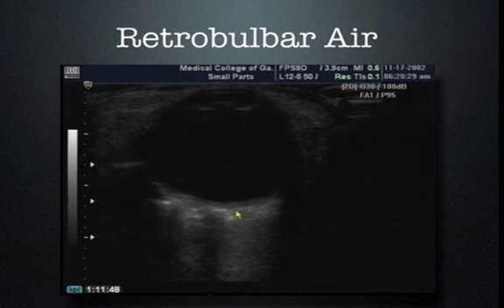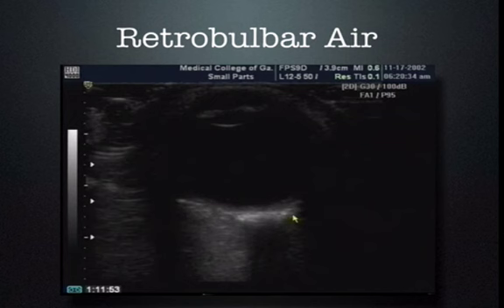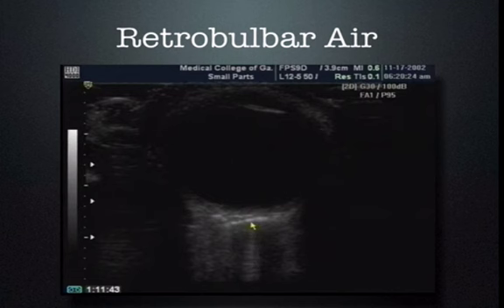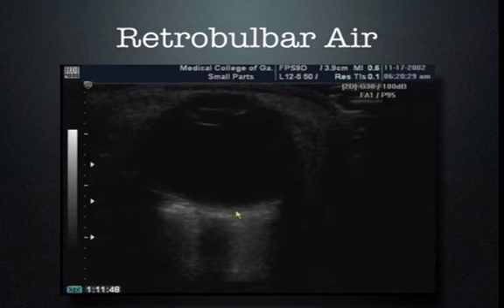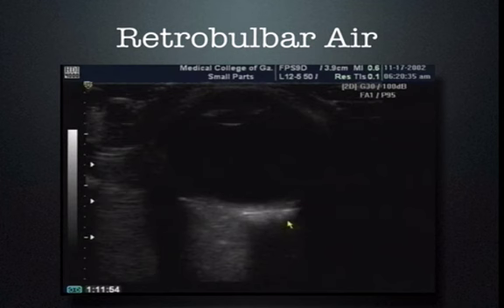Retrobulbar air will be found in some cases. The air appears as a bright echogenic line causing a dirty shadow, and it moves with patient positioning or head and eye positioning. This could indicate a sinus fracture or something else. It's easily seen because air is quite echogenic and causes that typical shadow appearance.